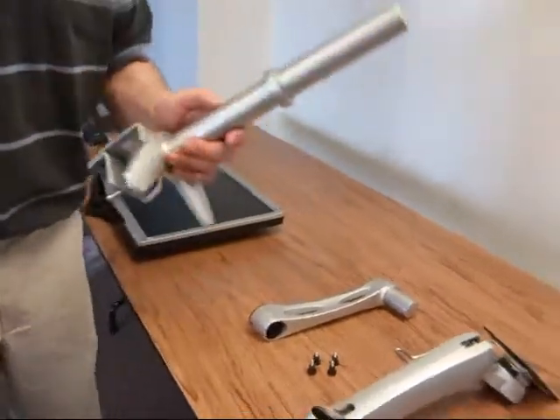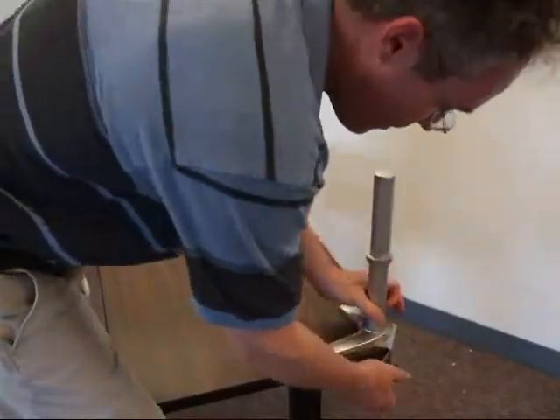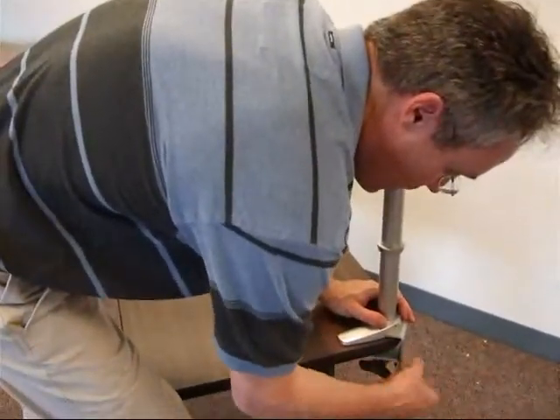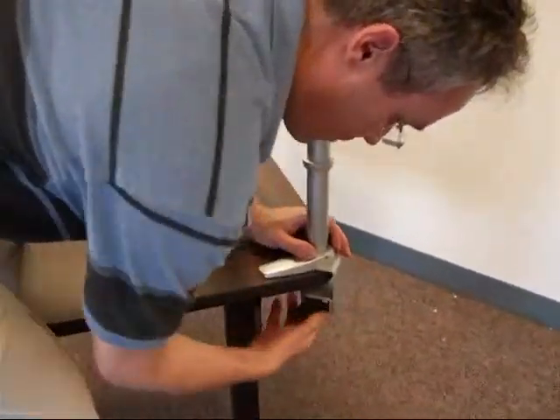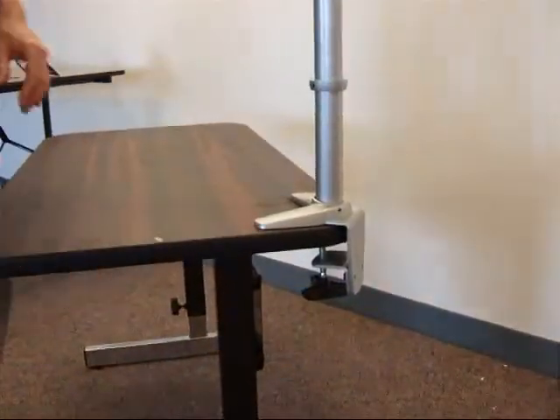Let's start with the monitor arm. I take the table clamp here, put that right here in the corner, and tighten that really well to the table to make sure that it cannot wobble.